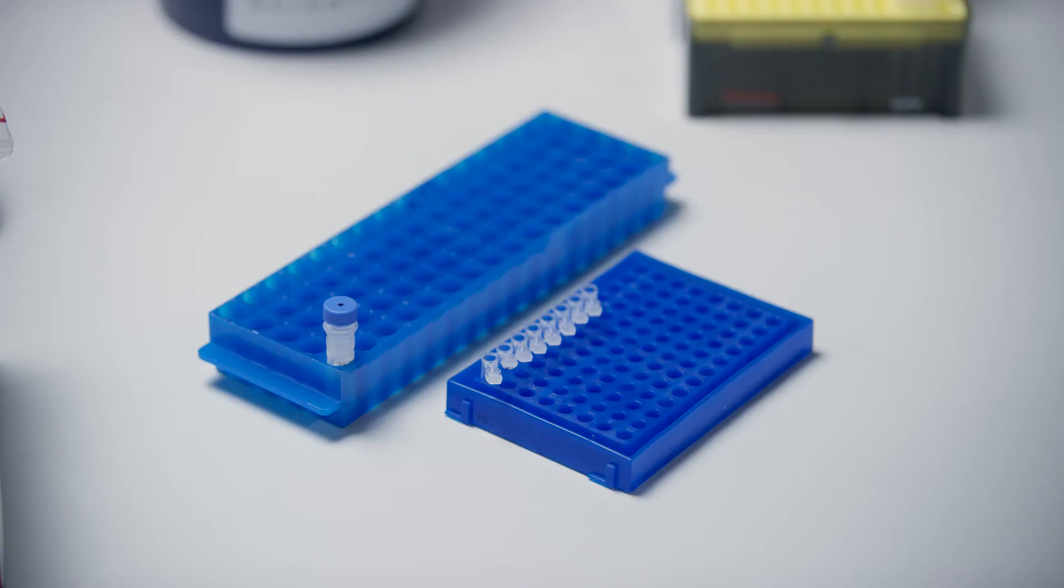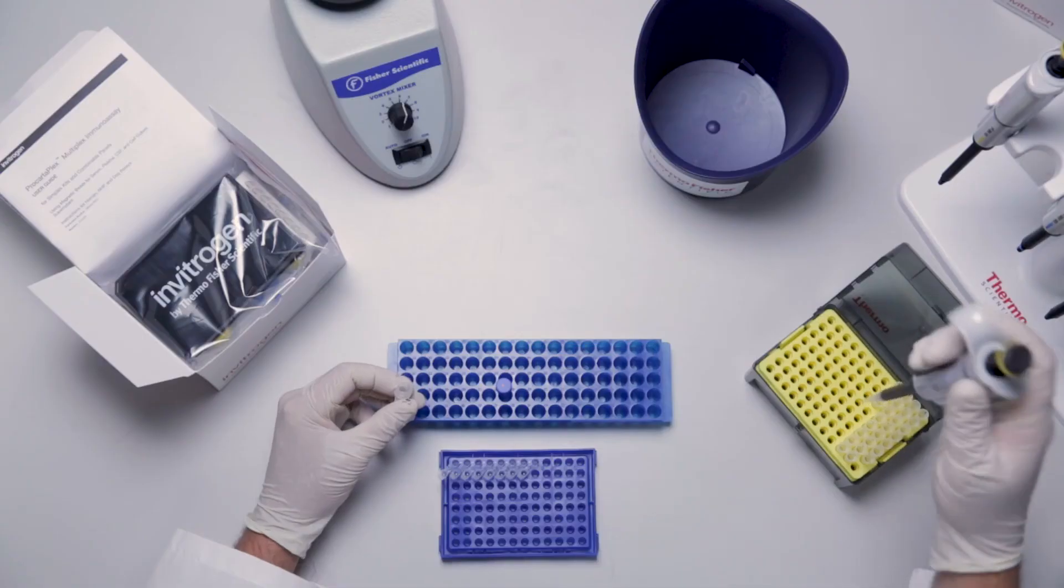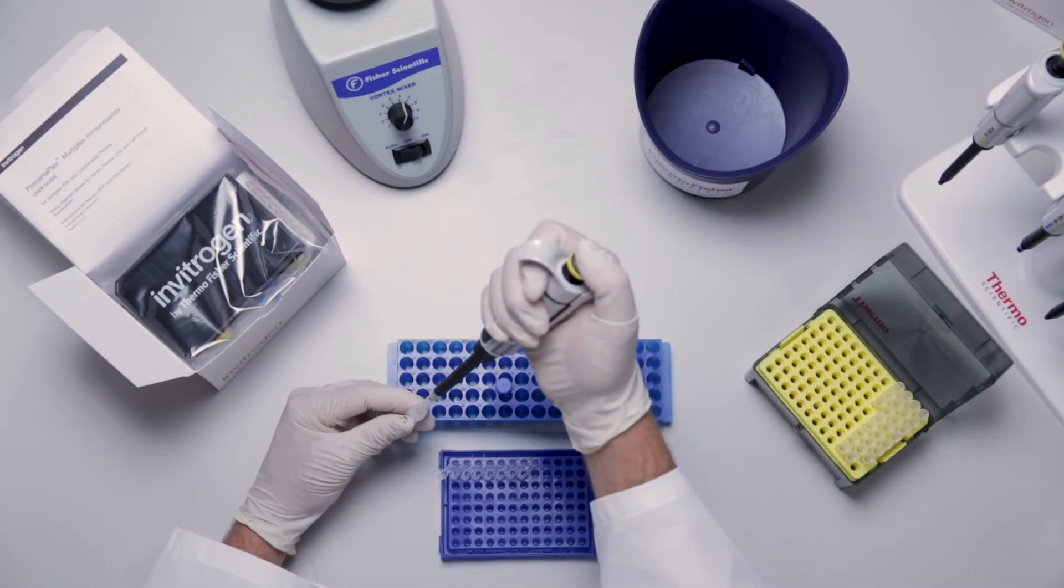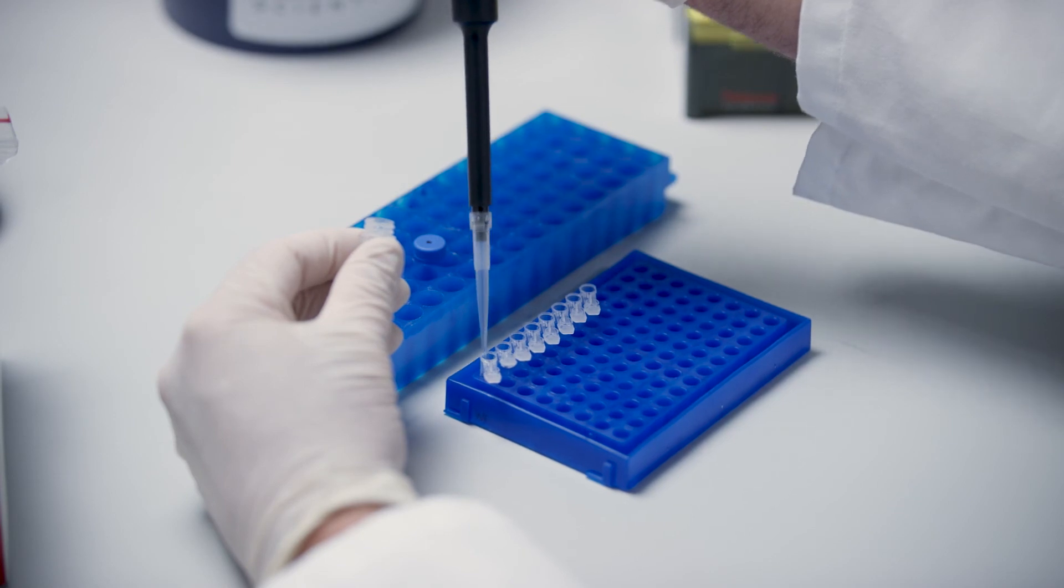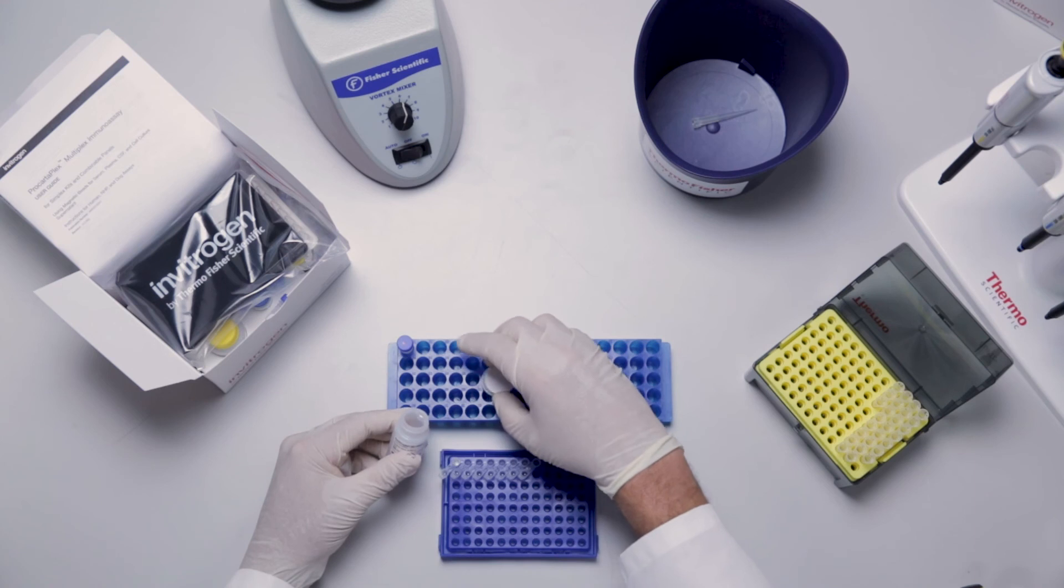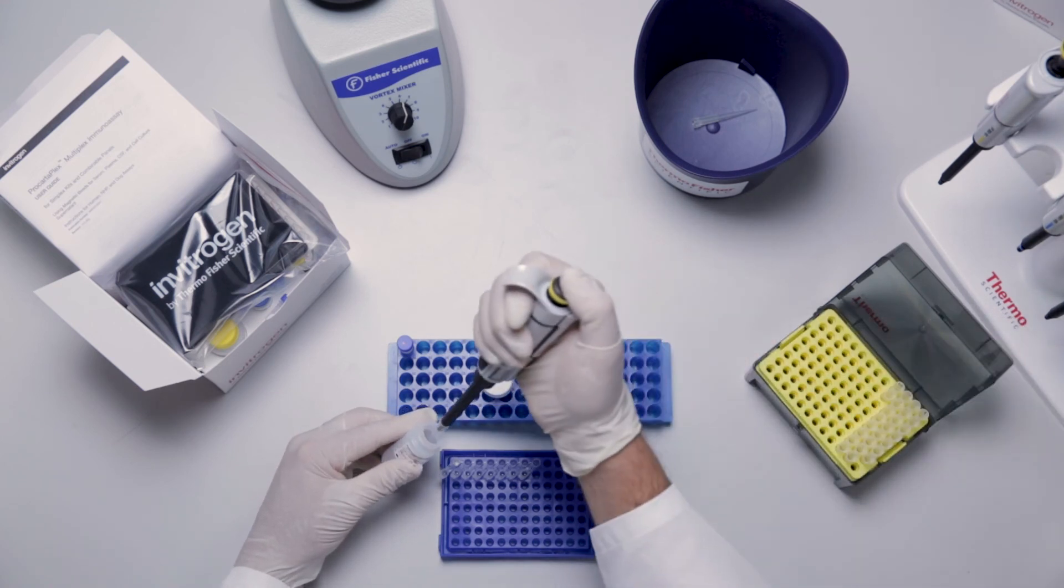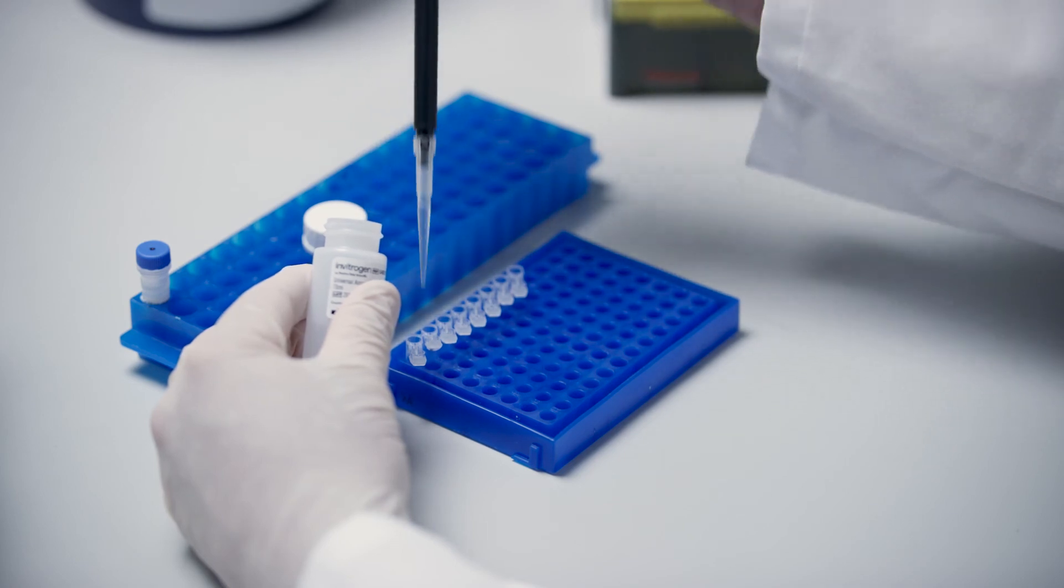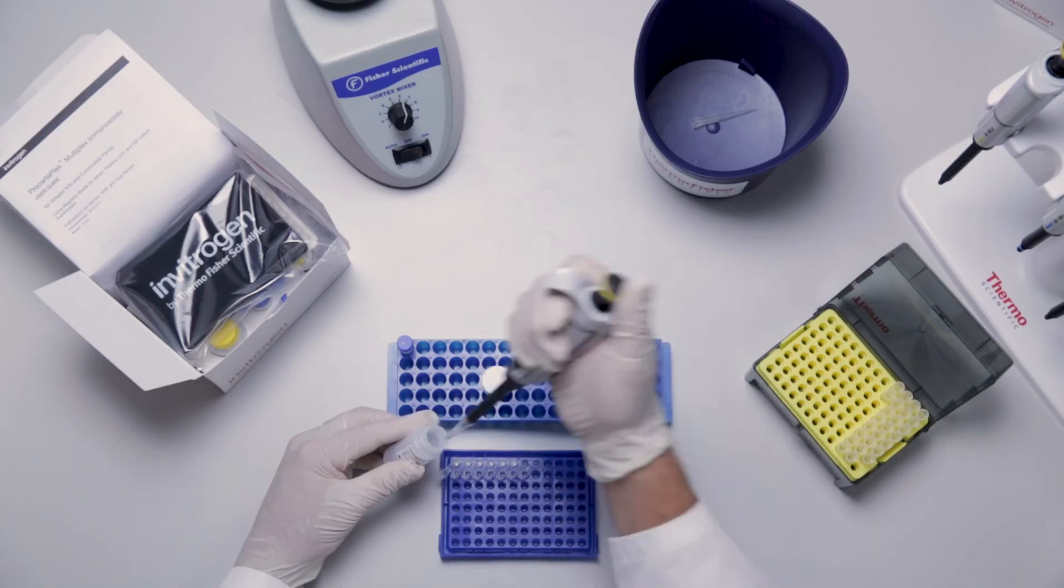Add 200 microliters of the working antigen standard into the first tube labeled standard 1. Add 150 microliters of universal assay buffer or cell culture medium into standard tube 2 through standard tube 7 as well as 150 microliters to tube 8 as a background.